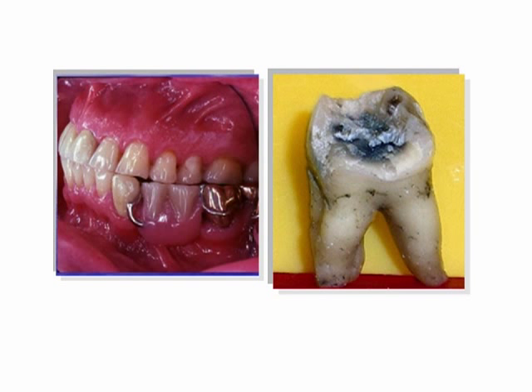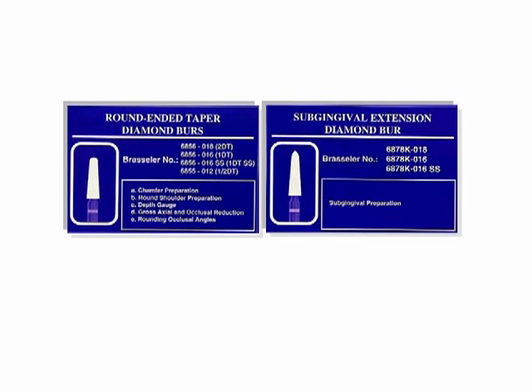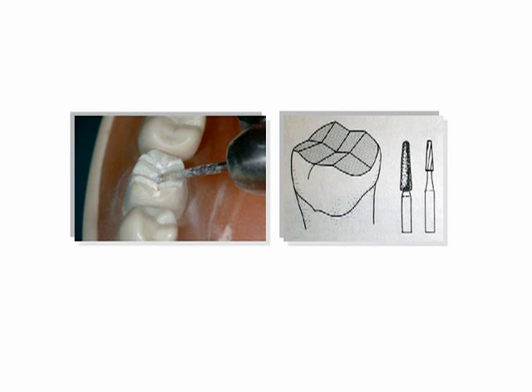The slide illustrates cutting instruments needed to prepare the tooth. Step 1. Reduction of the occlusal surface. Use your Boley or gold gauge to measure width of the burr. Depth cuts are made. 0.8 mm in the central groove, 1.2 mm at the cusp tips. Measure these depths with a periodontal probe.